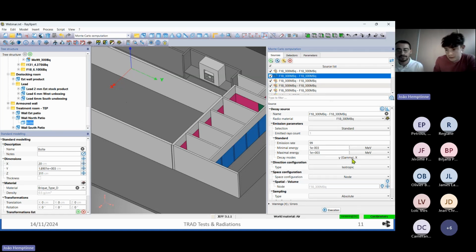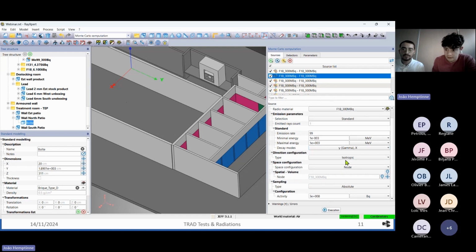Here, I just want to take into account the X or the gamma ray, because in radio protection issues, excuse me, we don't take into account the electrons, but we are more focused on X and gamma. And for the fluor 18, it's the ray of interest. Is the 511 keV ray.